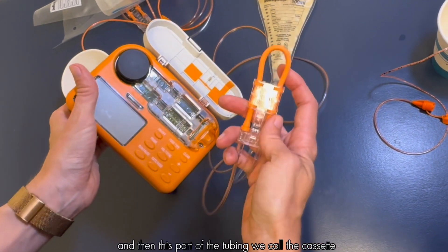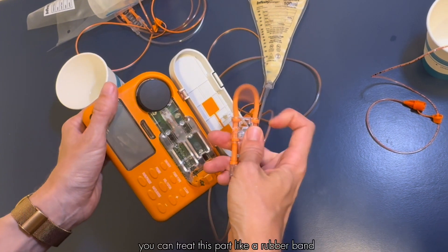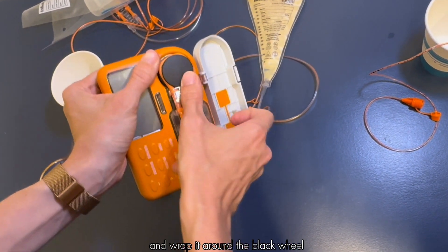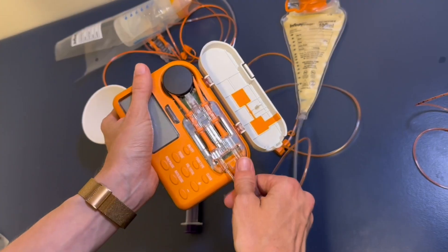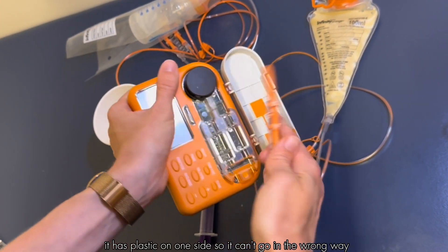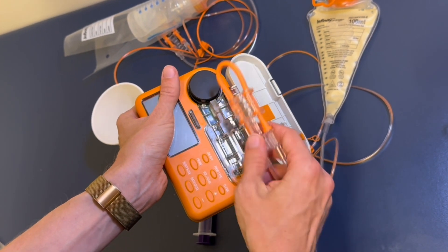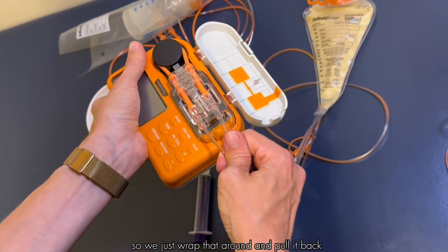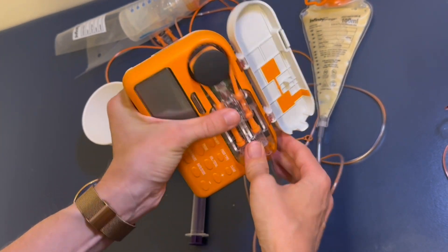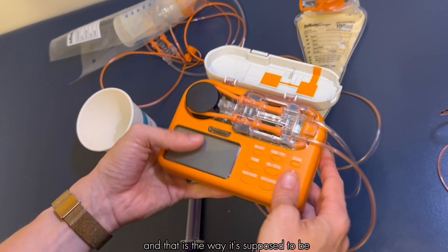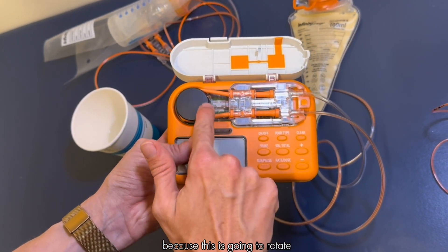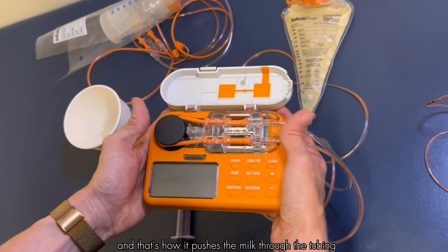This part of the tubing we call the cassette. You can treat this part like a rubber band and wrap it around the black wheel and then pull on these tubes to stretch it back and it will snap into place. It has plastic on one side so it can't go in the wrong way. Sometimes people ask if it's supposed to be tight here on the wheel and that is the way it's supposed to be because this is going to rotate and that's how it pushes the milk through the tubing.